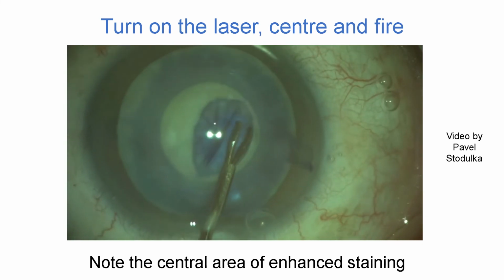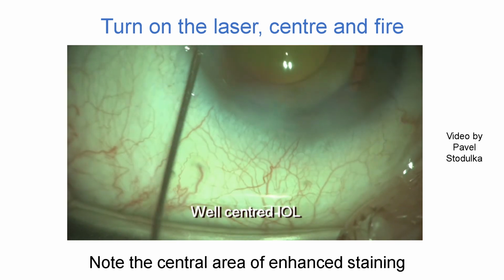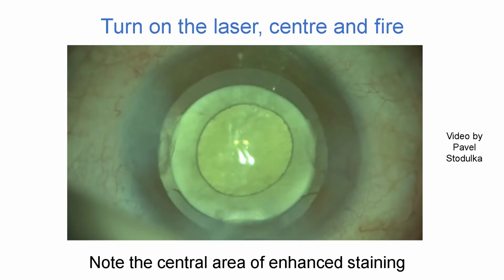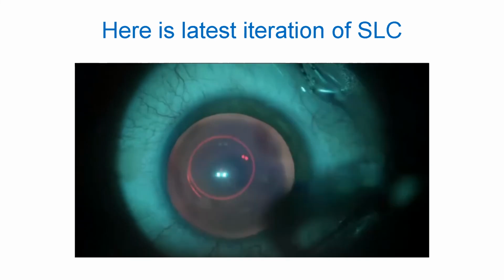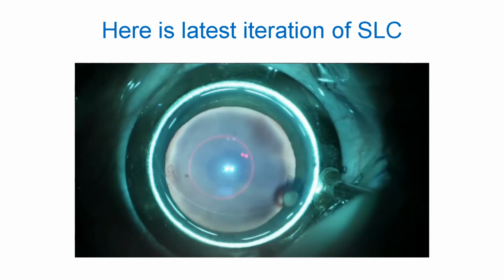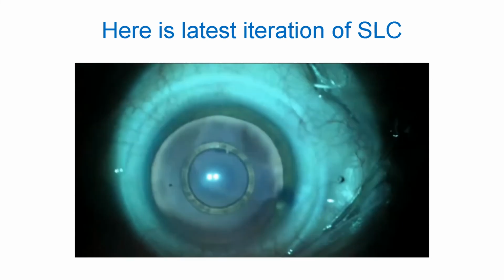This is again a video from Pavel Stodulka, and he's just removing the capsular cap. You can see that the soft lens matter has been kept at bay. The procedure is now at an end, and the capsulotomy is well centered with good 360-degree coverage of the IOL. And here is the latest iteration of SLC, this time using a Thornton ring to help center the beam on the enhanced trypan blue staining area. Once you've got it in position, the foot pedal is depressed and the capsulotomy created.